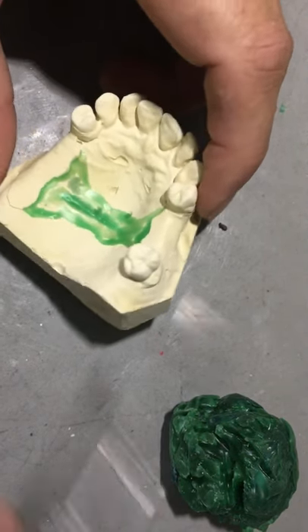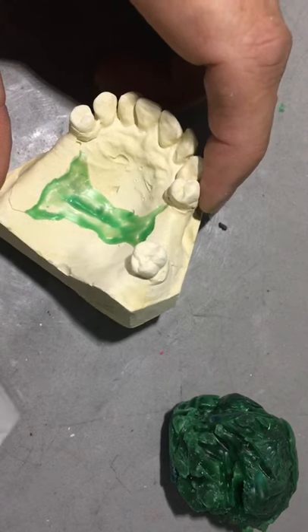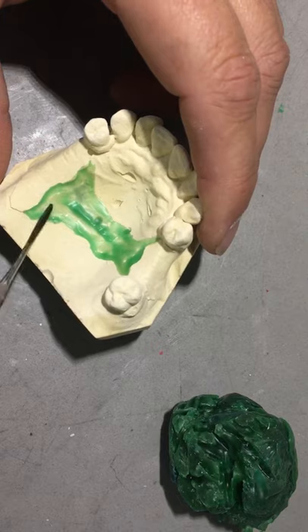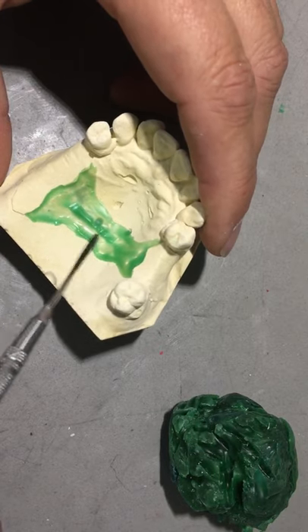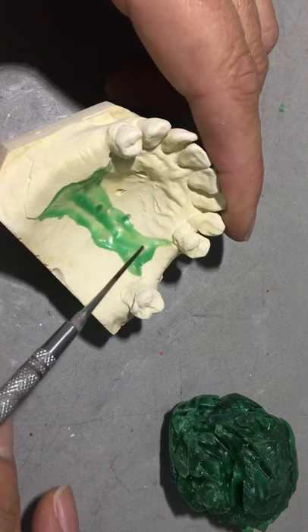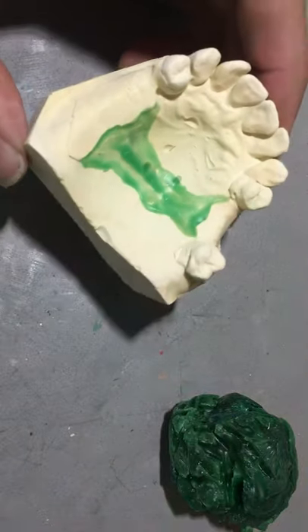Depending on the thickness of the stippled pattern sheet we're going to use, it will depend on how much free-flowing wax you'll put underneath. If we used a thicker sheet, like around 0.9 or 0.8, then you could forego some of this extra wax I'm adding underneath to create the thickness. But I'm going to be using about a 0.6.